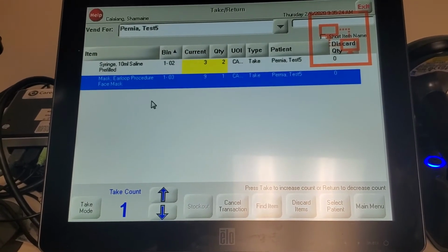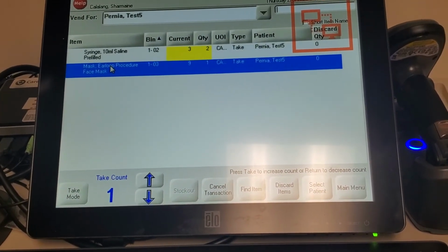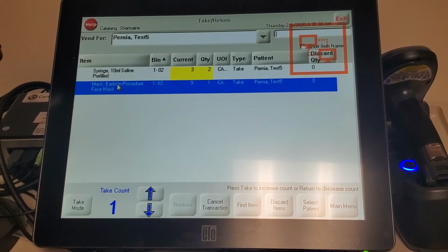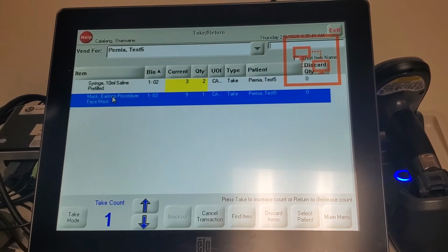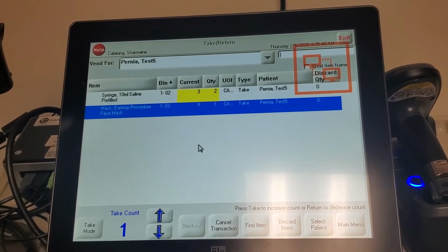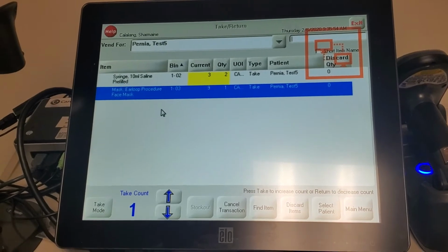So Jody, just to answer your question, Hans: we're looking to go live on March 1st for everybody, for all the nine stack stations, because we're trying to configure all the items first and put them in there. Then we're going to do in-service for all of the units. ICU already has the cabinets, the expensive ones. Are they going to be color coded? Are they using a charge voucher at all? No more charge vouchers. That's the goal, to eliminate the charge vouchers.